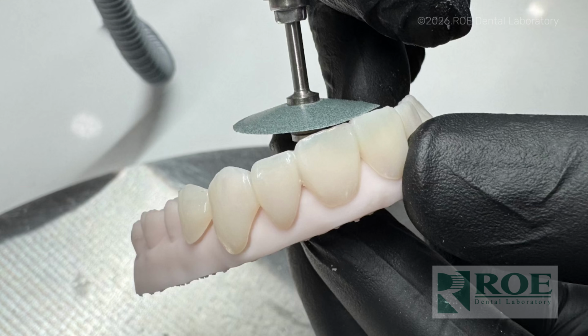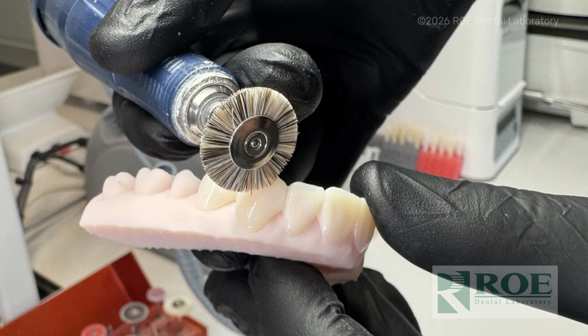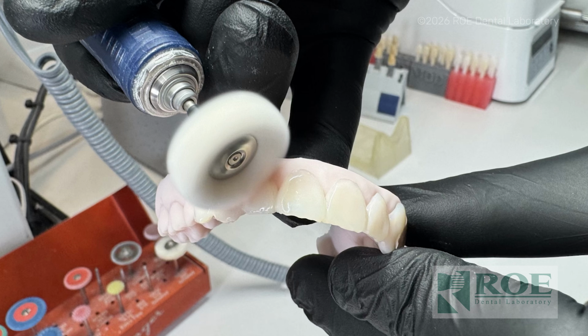And then at this point, you have two options. You either can polish these things or you can paint them and glaze them. Polishing is super easy with the denture tooth resin. You literally just, I will micro etch it usually with aluminum oxide, and then I'm literally taking a bristle wheel, then I'm going to take a buff polisher, and that's it. These things turn out shockingly smooth and polished.